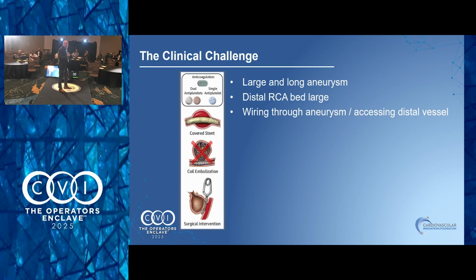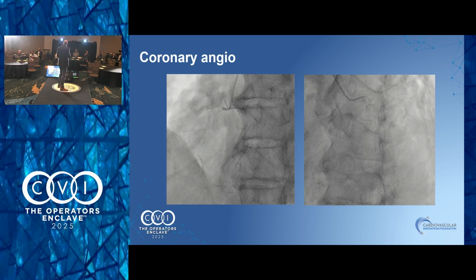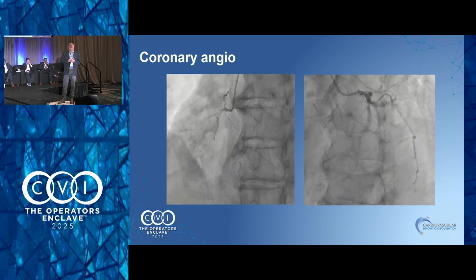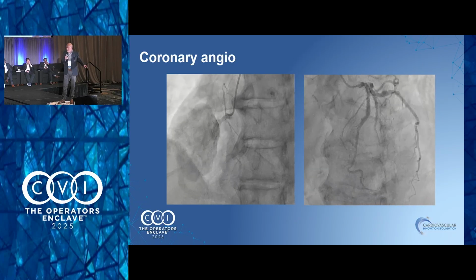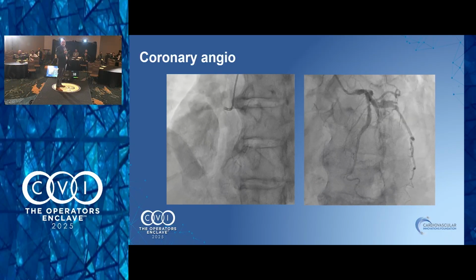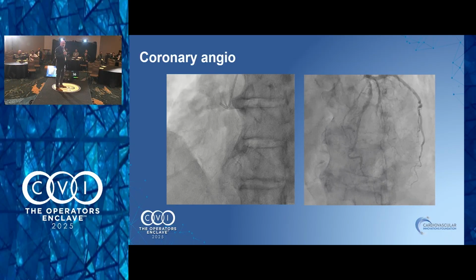Because I can't tell where that coronary artery is going. It doesn't look like it's going anywhere. So the CT said this right coronary artery is closed. Closed. Okay. But what do you think about this angiogram, though? You see filling. Is that just calcium? Or do you think a little contrast is entering that distal right? It's almost like a giant pseudoaneurysm connecting the proximal and distal ends of your right coronary artery.